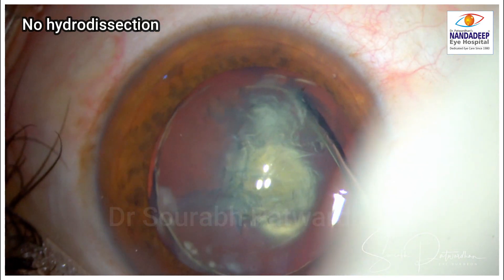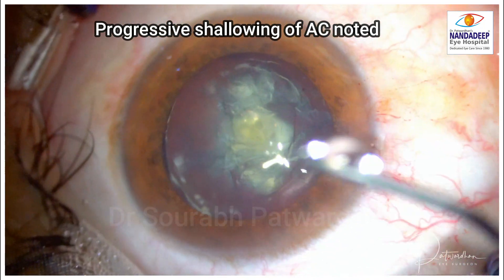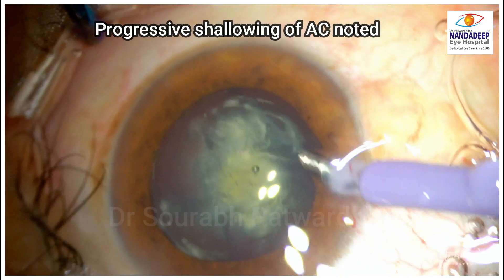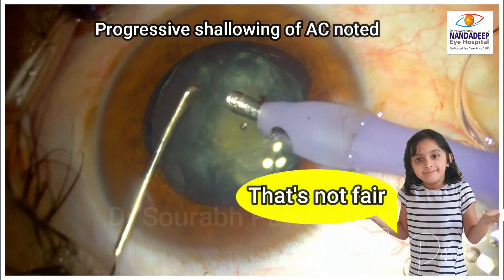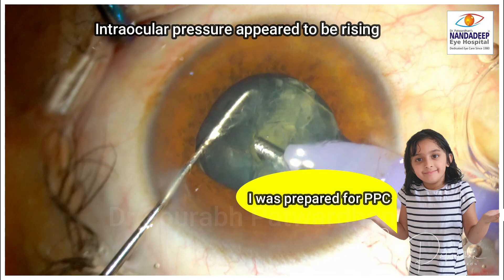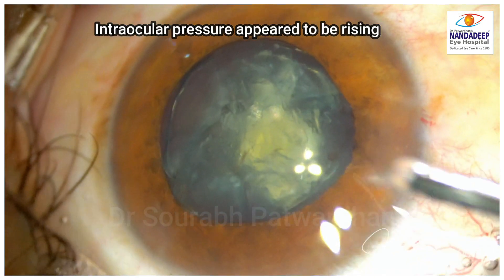As I was doing the hydro procedure, I noted progressive shallowing of the anterior chamber. As I tried to push OVD, the AC became even more shallow and intraocular pressure was also rising. I had prepared myself to tackle posterior polar cataract, but this was another problem. I stopped the procedure and tried to reform the chamber with OVD.